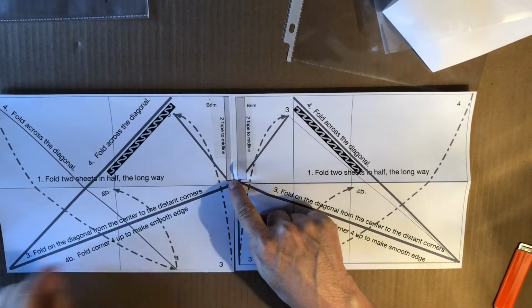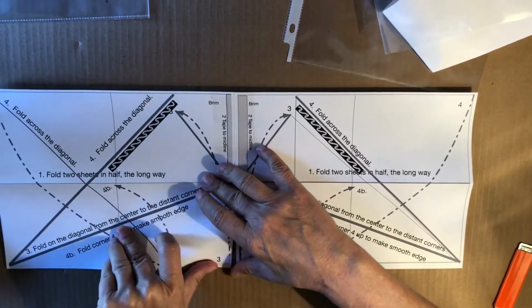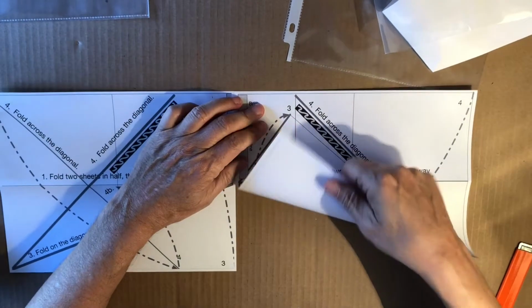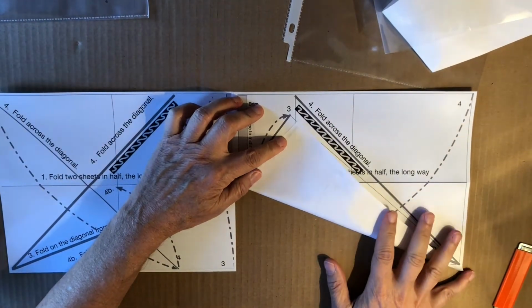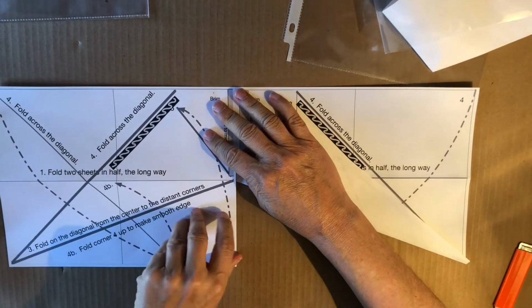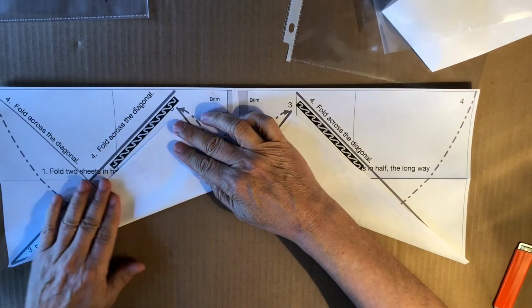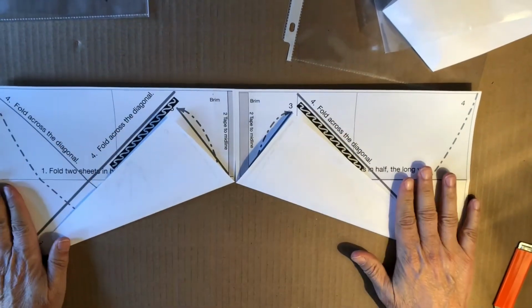Step three, fold from the center to the distant corners. Can you check to see if I'm still in frame? Fold from the center to the distant corners. But I think you are. And you can see I've got a 3 here, and it meant it goes to this 3 here. So here we go. Yeah, you are. Okay. And you line it up to the distant corner, like that. This is not high precision. Okay, we do the same thing here. Okay, so there you go.